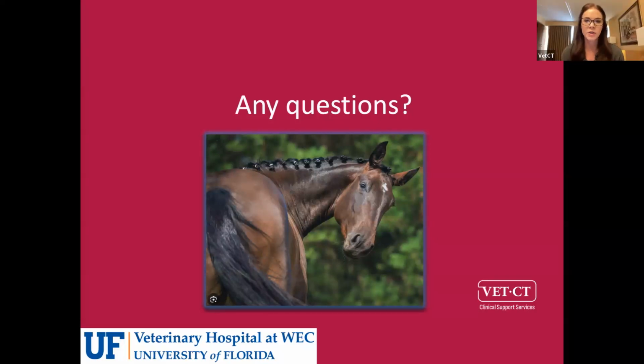Next question. How do you move the neck of the horse to extend and flex in CT? Just manpower? They said we have a CT with a diameter of 90 centimeters in our clinic. How do you scan the flexed neck? So the scanner that I'm using is specifically modified for recumbent horses. So they're down on the ground level.